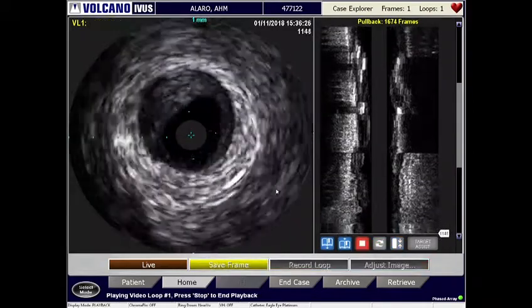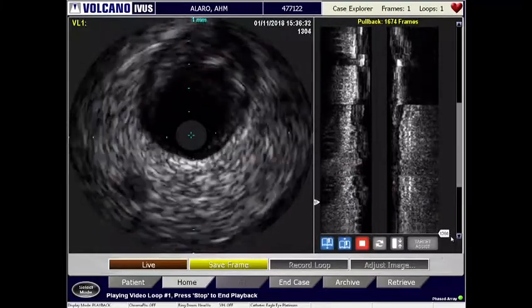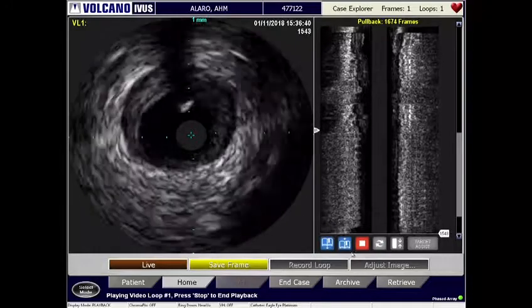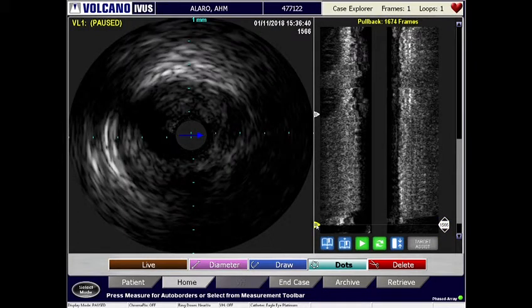Now we have... If I may interrupt, in this position probably, if I would have done live IVUS, it wouldn't help much because the cap is too far away from the IVUS. Yeah, because there is the notch. Now we are in the left main that we measured. At this level, it was 5 millimeters square, which is not enough for a left main. And this is media 5 by 5. The proximal LAD itself is a 4 millimeter media, and a 3.5 millimeter stent would fit, so no problem.